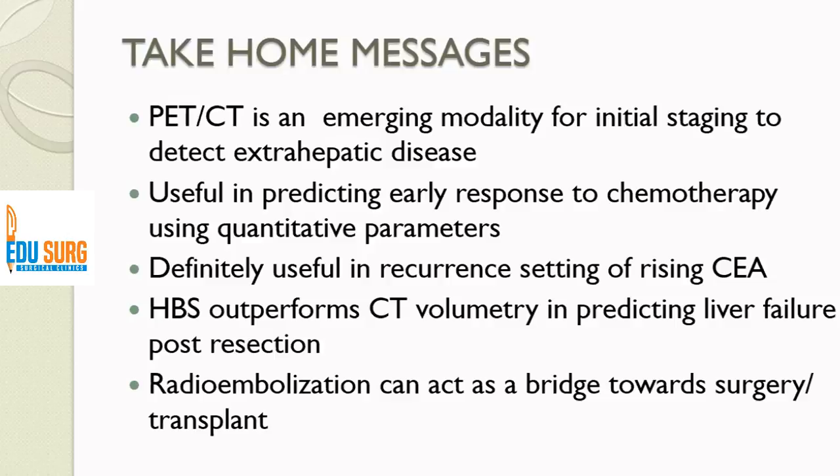Also, hepatobiliary scintigraphy outperforms CT volumetry in predicting liver failure after resection, and radioembolization can act as a bridge for surgery or transplant and can be used in the first-line setting.